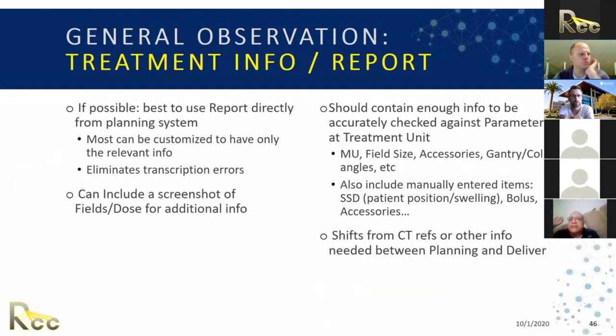For the treatment info and reports, again, this is very dependent on how your system is set up, but if you have the ability to print a report from your treatment planning system, I think that's excellent. You basically take a report, print it, and either embed it into the system or just print it out and give it to the therapists to look at. That way there are no transcription errors. And you should include, sometimes you can, we do this, a screenshot of what the plan looks like.